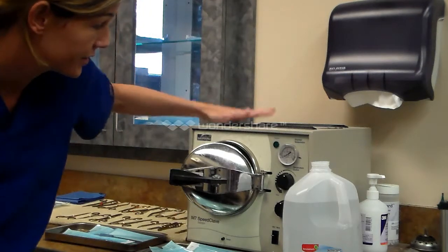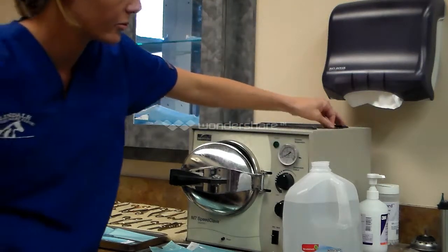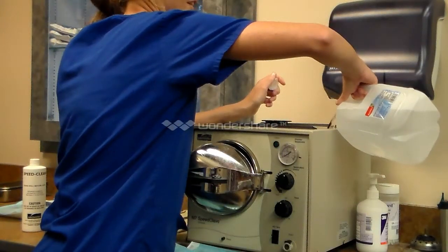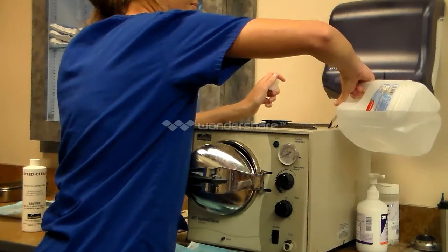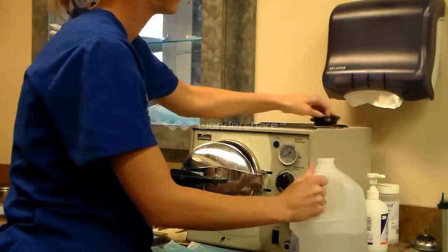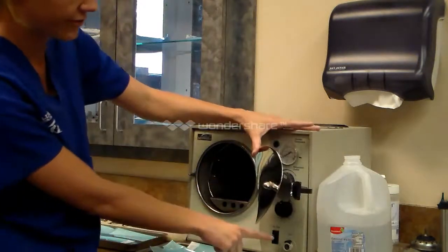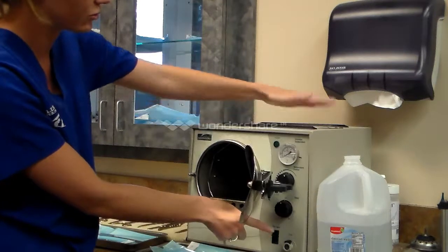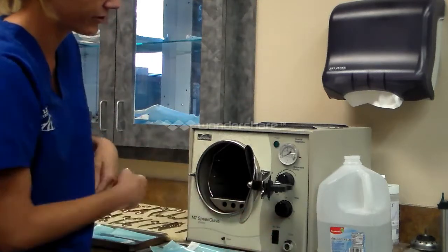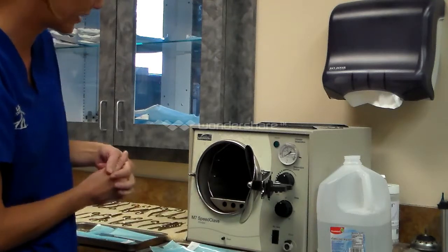Procedures and maintenance. So this is a steam sterilizer. It's an older model. We use distilled water in it. It's filled through a reservoir back here in the back, and there's a fill line inside. Once our reservoir is filled, there is a fill switch here that we'll use, which will move the water from the reservoir into the chamber. So we're going to depress that, which I've already pre-filled it because it takes a second. So we've held this down, filled up our chamber up to, again, the fill line with water.